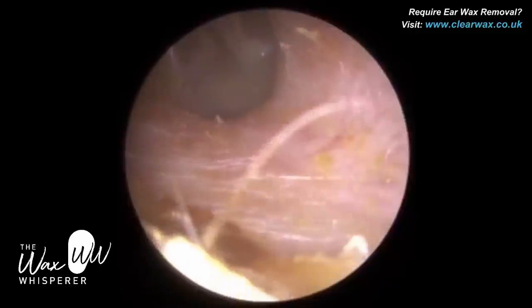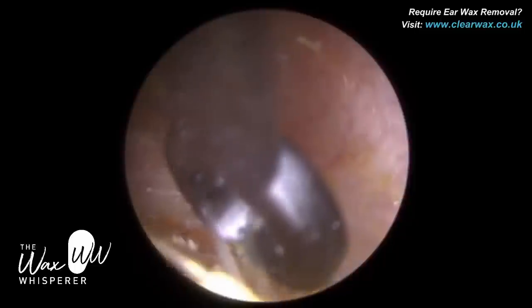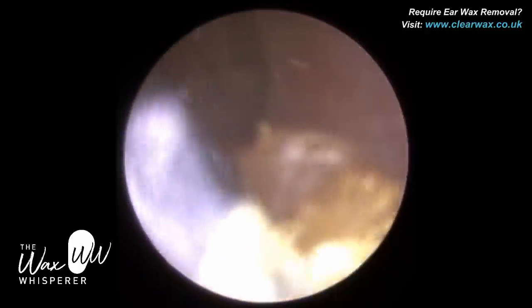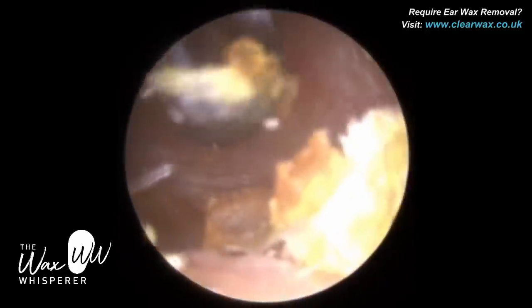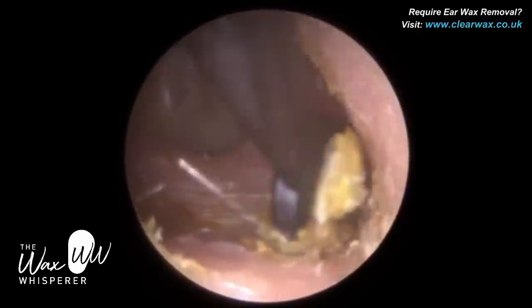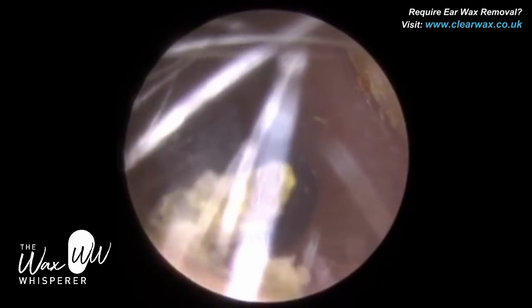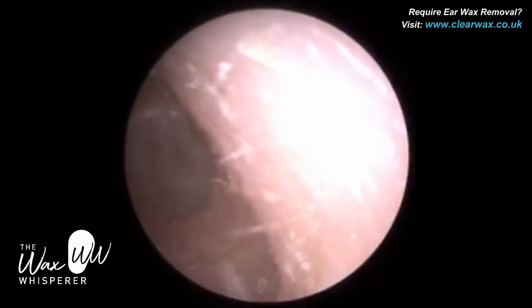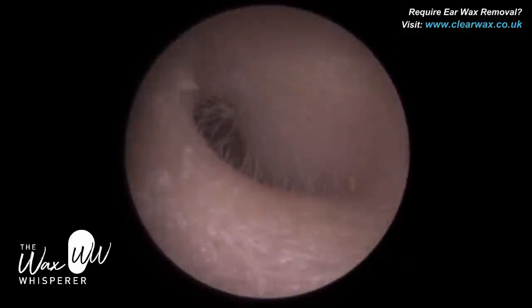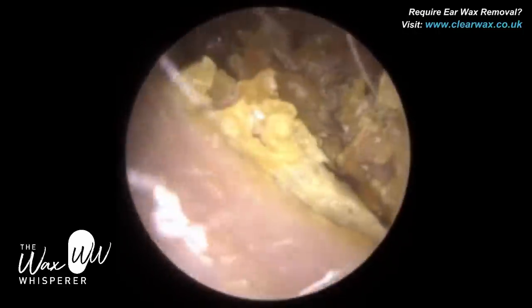So what a microscope does is very clever — it artificially converges your eyes together. Think of a periscope on a submarine: you've got eyepieces on both sides, and the optics of the microscope artificially bring your eyes together. It narrows what we call the interpupillary distance — the distance between both your eye sockets and pupils — so you're looking at the object inside the ear using both eyes.